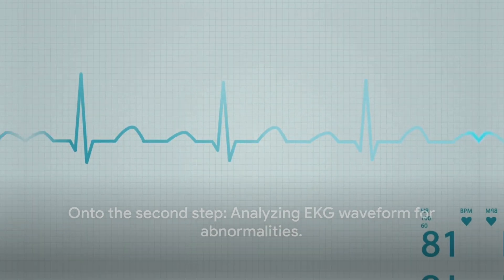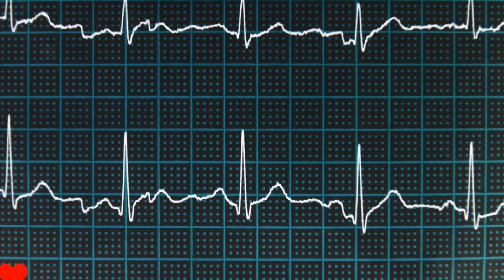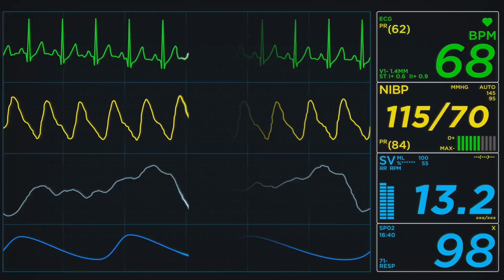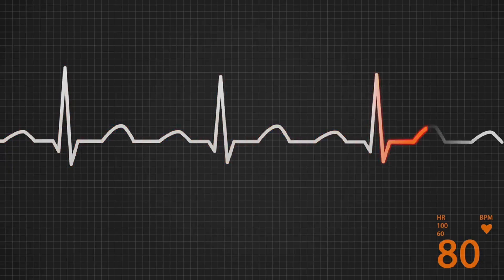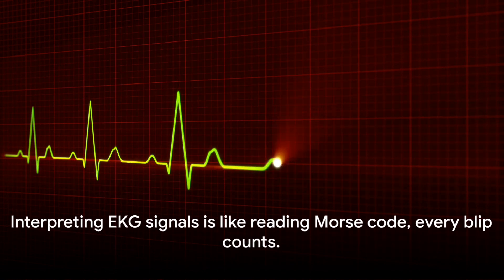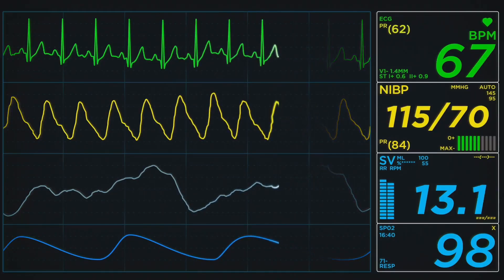Next up is the QRS complex — wide or narrow. This complex, the powerhouse of the EKG strip, holds crucial details about the heart's electrical activity. Its width, in particular, is a revelation. A wide QRS complex might indicate a delay in the ventricle's electrical conduction, possibly due to a blockage or damage. On the other hand, a narrow QRS complex suggests that the heart's electrical system is functioning properly. Reading these signals is like reading Morse code, where every blip counts.